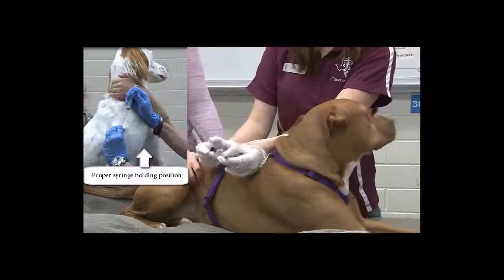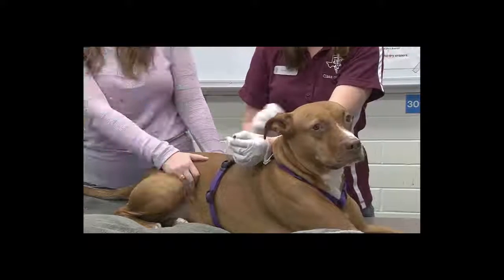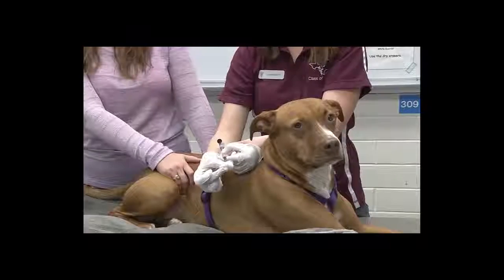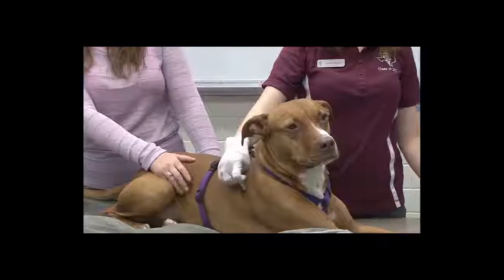Then once you pull back, you slowly push all the way down until all of the liquid is out of the syringe. Then you're going to put a cotton ball or something where the needle touches the skin. Pull the needle out, and then you've got your pressure to hold it just in case it leaves a drop or two.